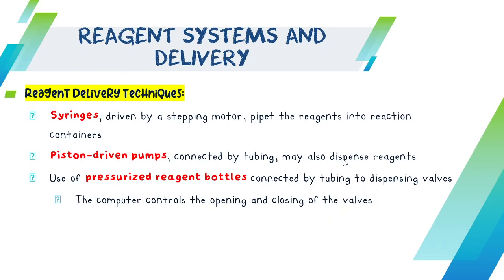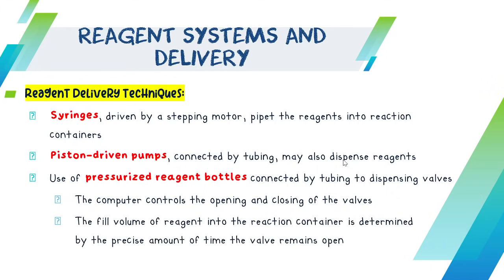Now, these pressurized reagent bottles are computer controlled in terms of the opening and closing of your valves. The computer controls when they get or not get your reagents. The fill volume of reagent into the reaction container is determined by the precise amount of time the valve remains open.